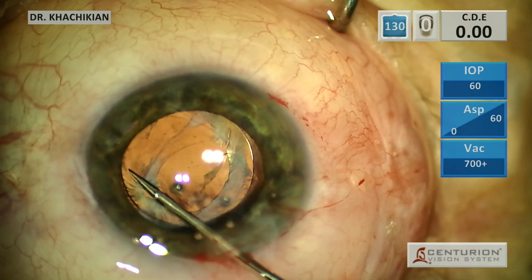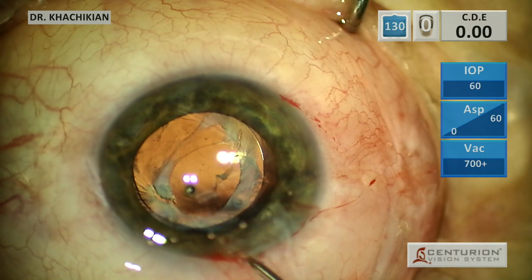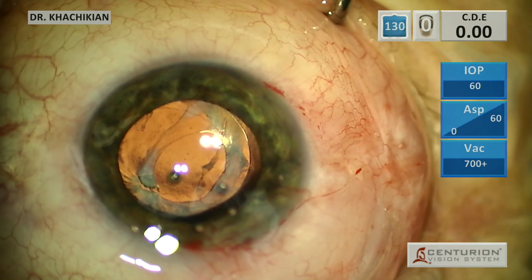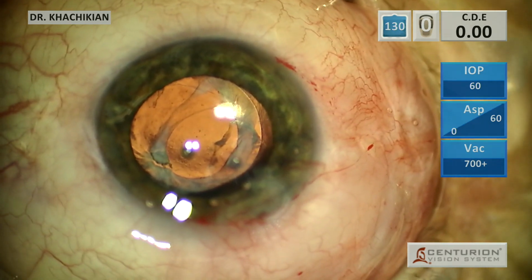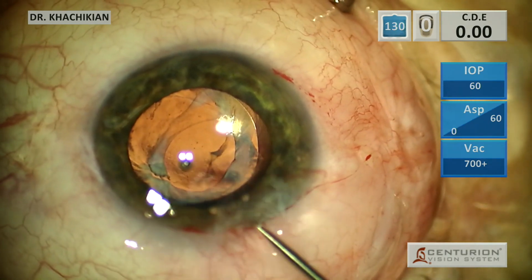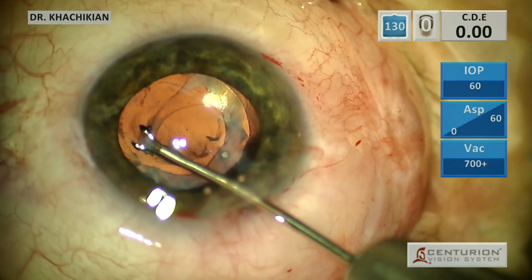So let's see what we can do here. We'll cut that with our MST graspers. And let's see how much we can tear here. It'd be nice if I reinflate it with a little more viscoelastic. It looks like that eye is a little bit soft. Let's see what we do. Nope, no such luck. There we go.